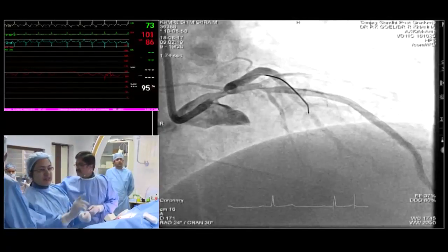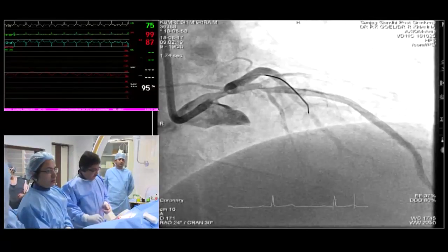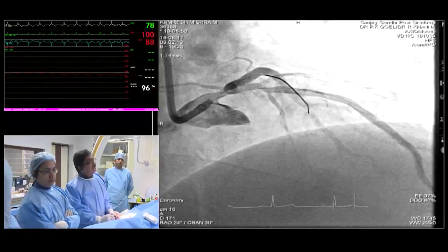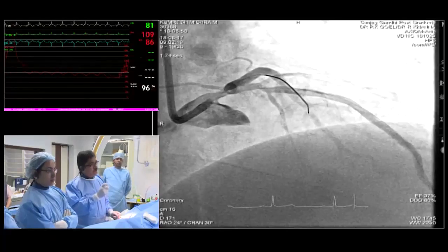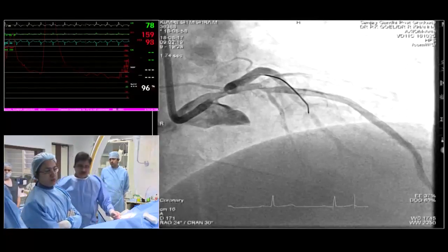Dr. Goel, what you said is in the long left main. Here, the left main is short. Anyway, you need to cover the ostium, right? Let's see. No, because you'll go into the LAD. No. But you will cover according to the anatomy. Yes, yes. You will cover according to anatomy.